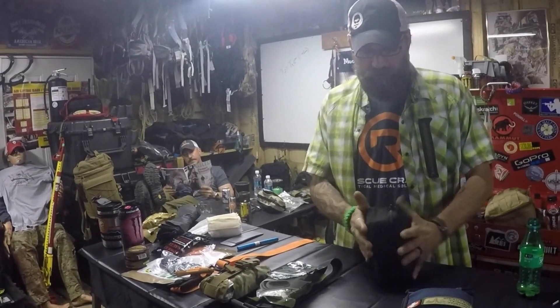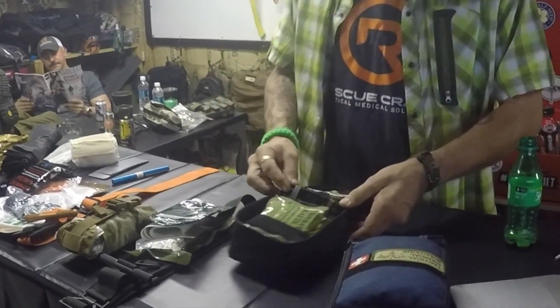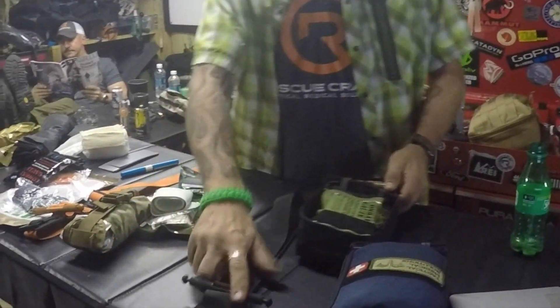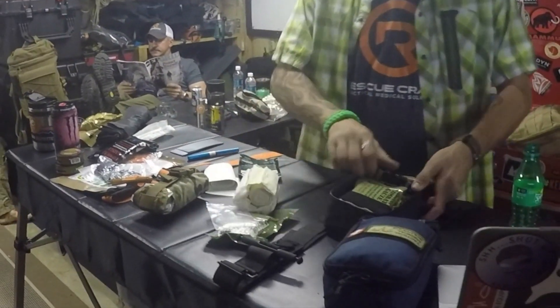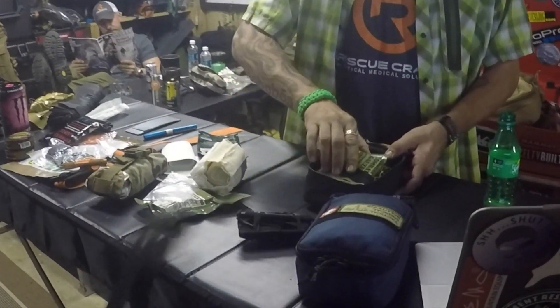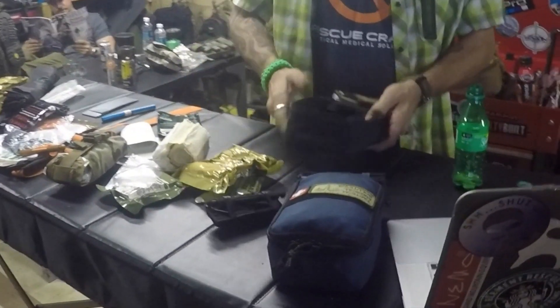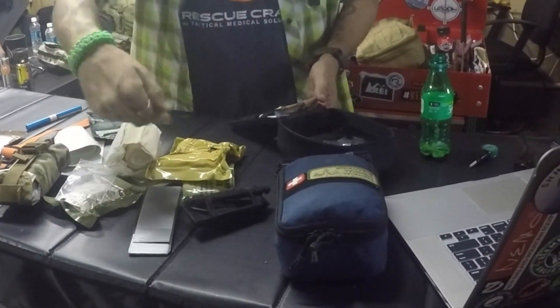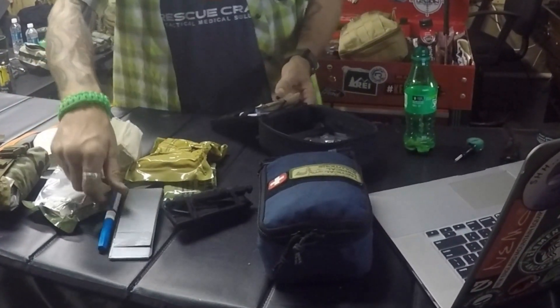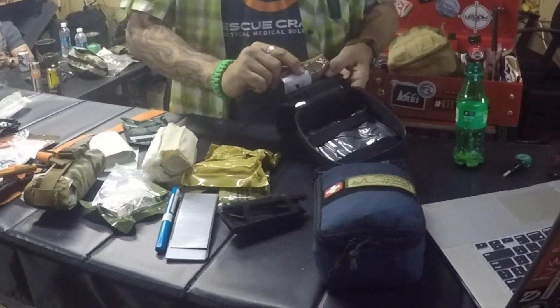This is in an Operator IFAC XL from TMS. When we open it up, right off the bat we have a Soft TW in there, a combat gauze — we're actually using a flat roll. Up front we have one of the Kydex duct tapes that fits in there, a 14-gauge 3-and-a-quarter-inch needle, and a Halo chest seal rolled up — actually the double pack.